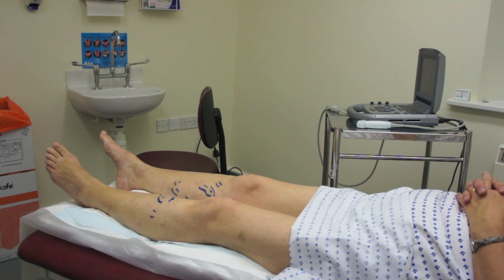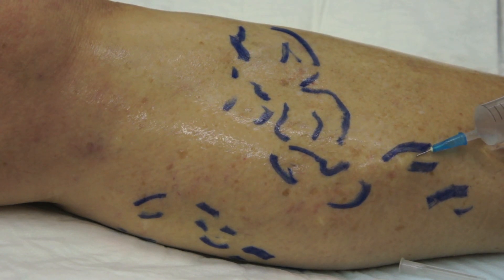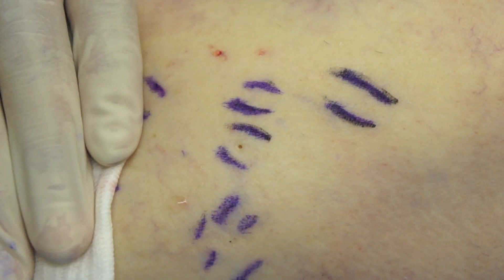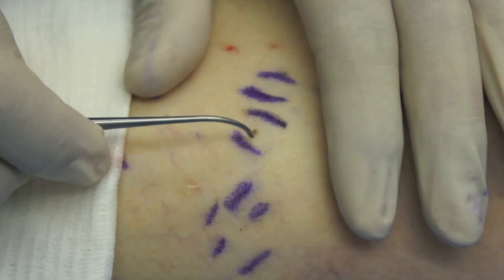I'm going to show you the technique, and I'm going to show you some before and after photographs. The varicose veins are marked with the patient standing, and then the area is infiltrated with Klein's formulation of tumescent local anaesthetic. The 1mm dermal punch is used with a rotatory twisting action to leave a circular defect in the skin 1mm in diameter.